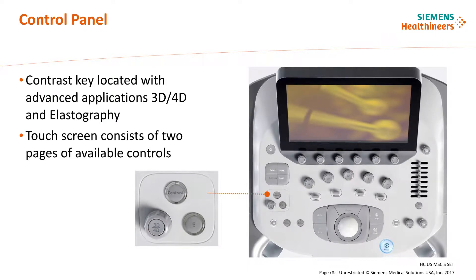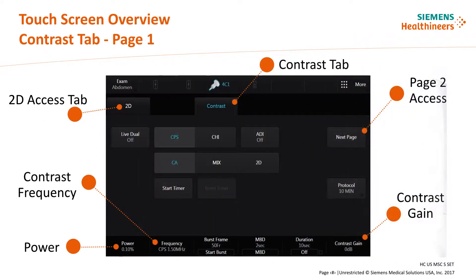To turn on the contrast software application, the key is located on the control panel in the advanced applications area on the left side of the panel. Once activated, the contrast key will illuminate blue. The contrast tab populates the touch screen adjacent to the 2D tab, which remains on screen and accessible while in contrast mode.